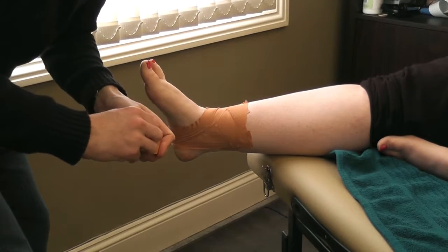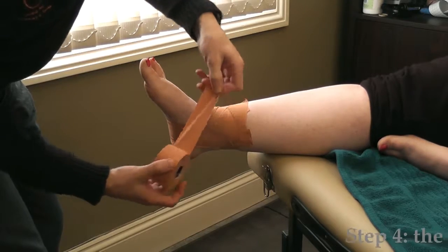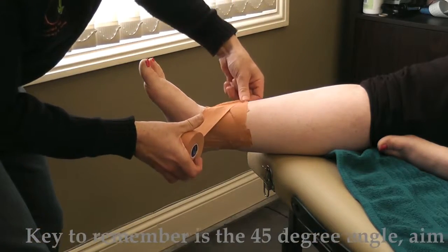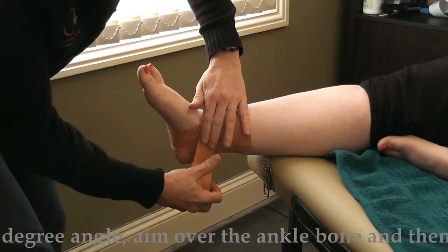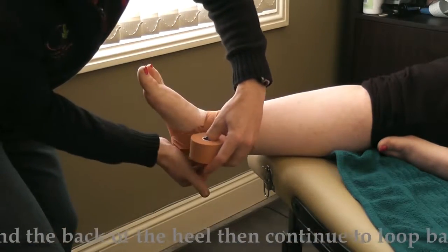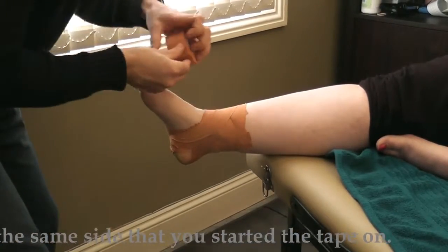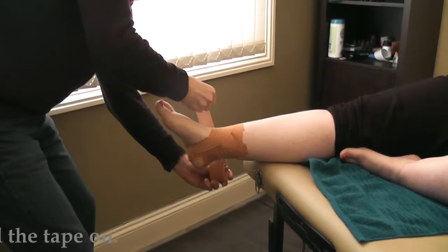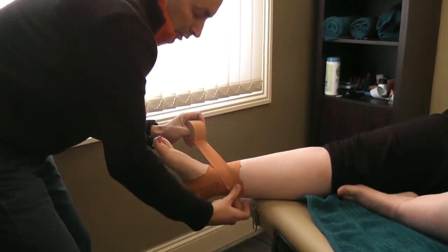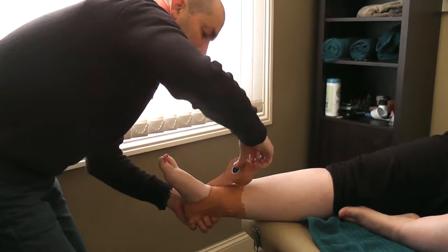It's called a heel lock and once you get the hang of it it's fairly simple, but it's just like riding a bike — it can be quite difficult at the start. So what we do is we find our ankle, we go about 45 degrees — so there's 90, there's another 90, so we go in the middle — and then we take the tape out and we join it onto the anchor up the top here, we take it over the top of the ankle, around the back of the heel. That's the other thing you've got to remember: wrap it around the heel and then straight back up the other side, the same side that you came. I'll just demonstrate that again — so we go 90, 90 and go straight to the middle, aim for that ankle bone, start at the anchor, over the top, remember you go around the back of the heel, looping around and then coming up the same side.